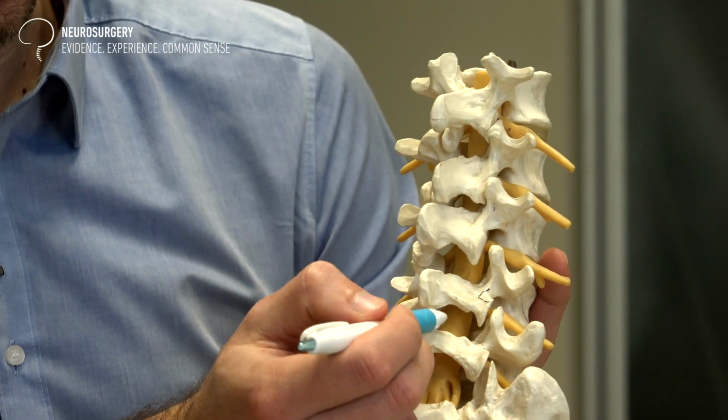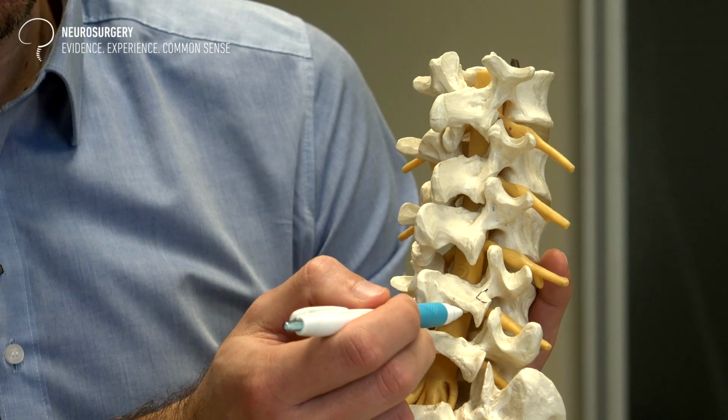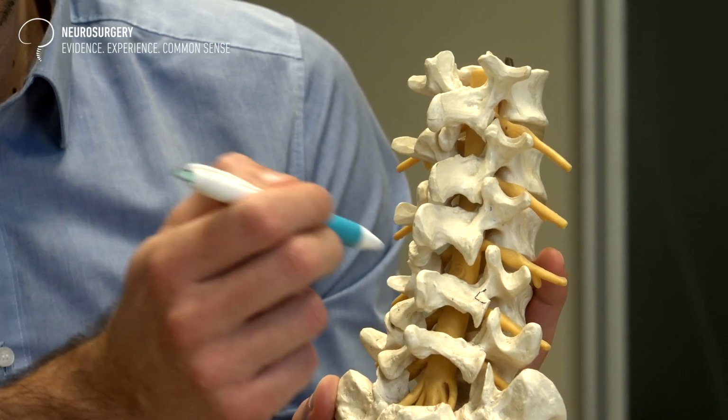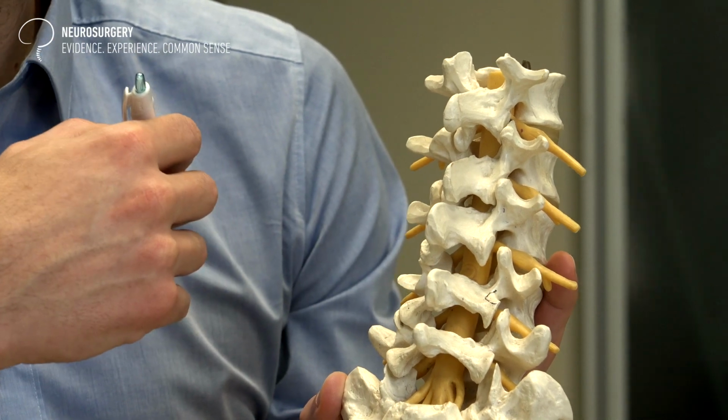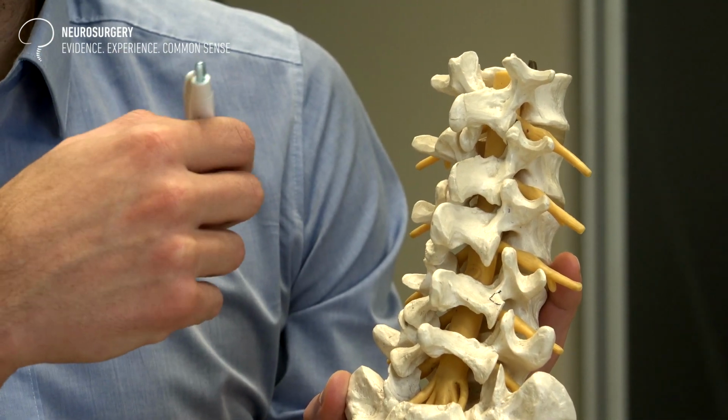Once we mobilize the nerve root, right behind the nerve root there is a disc herniation. So we take the disc herniation away. By doing that, we take some pressure away from the nerve root, and therefore we treat the patient.